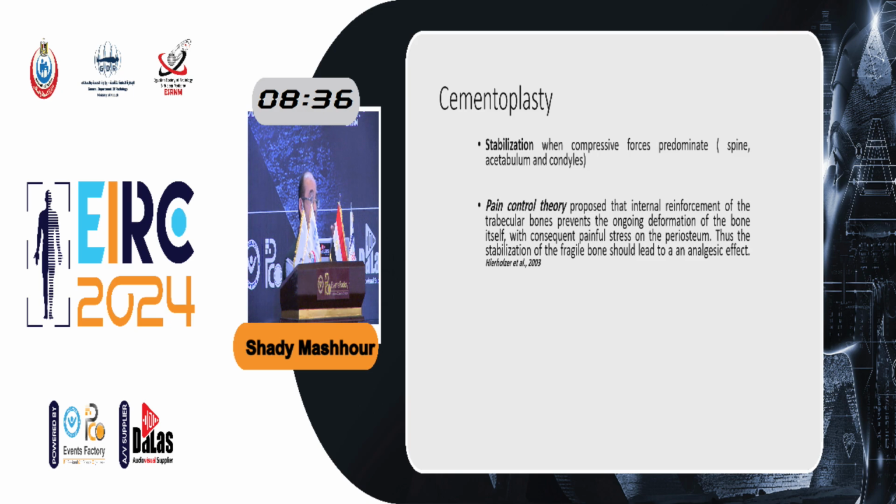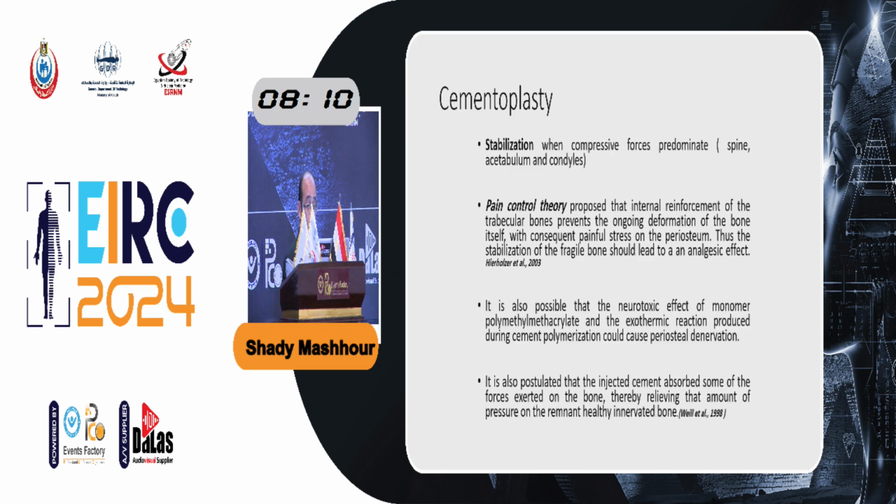The mainstay of consolidation is cementoplasty, especially in the weight-bearing areas where the compression force is highest. The compression from up to down, cranial to caudal, is the compression force. Okay? And for pain control, the cement reinforces the bone. Occasionally it produces heat, which causes denervation of the periosteum, so the pain is less, and it decreases the load on the normal bone, which also makes the pain less.